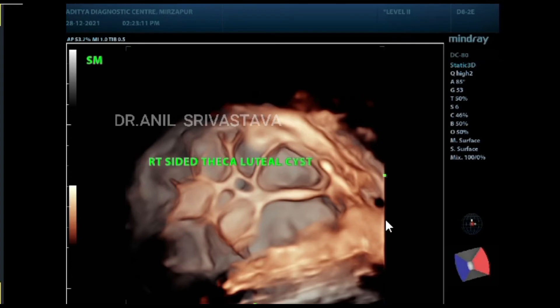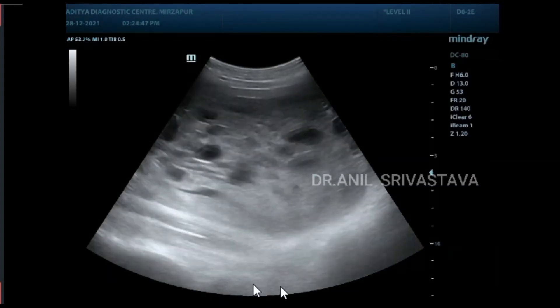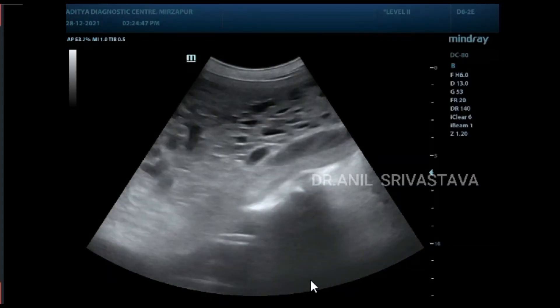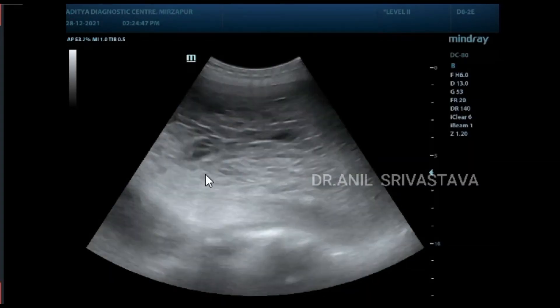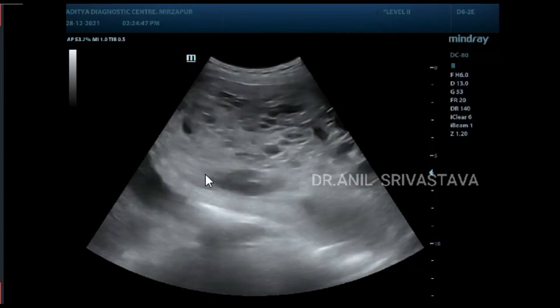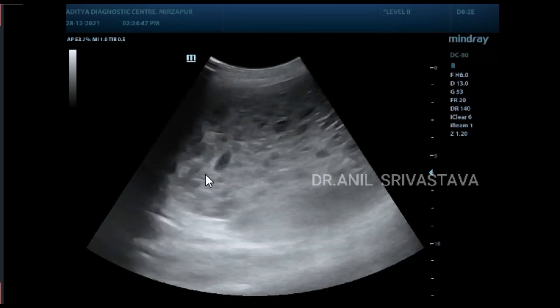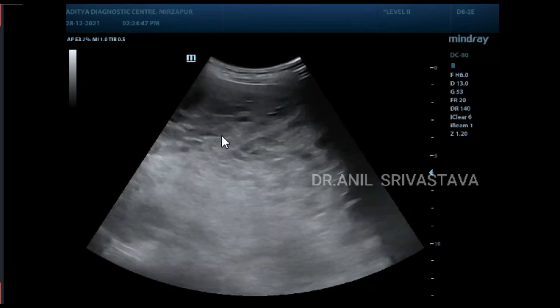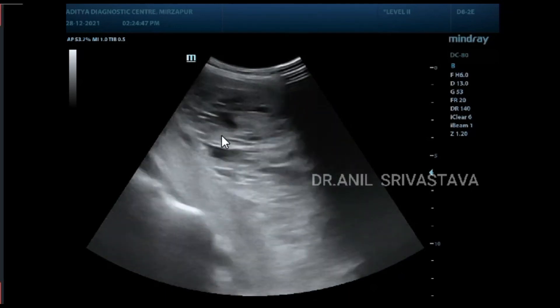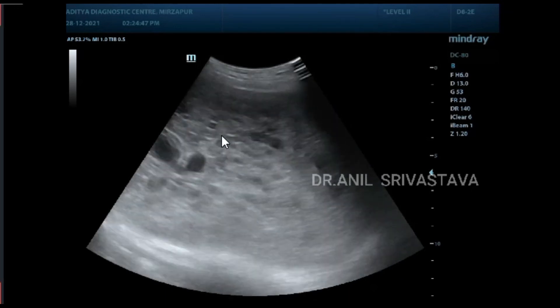This is the right ovarian cyst and this is the left ovarian cyst — this is the large cyst. In this video clip you can see the enlarged uterus showing multiple small cystic spaces.